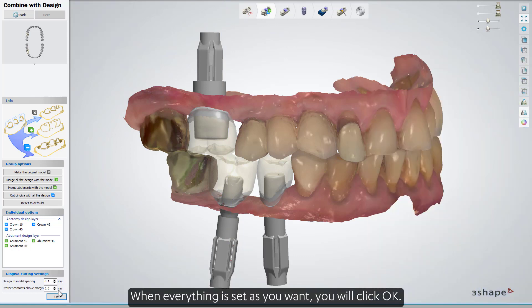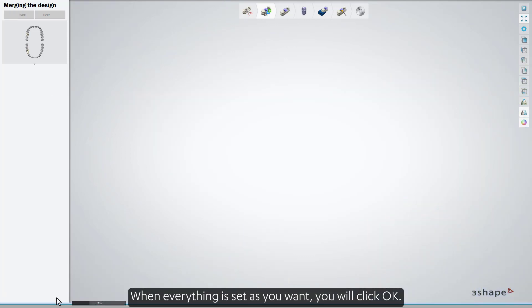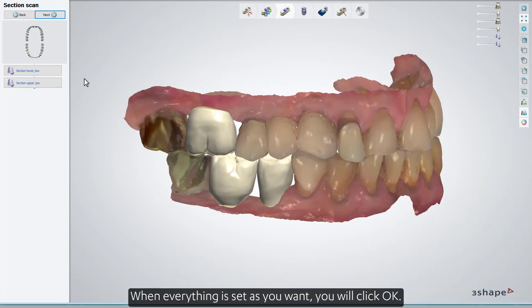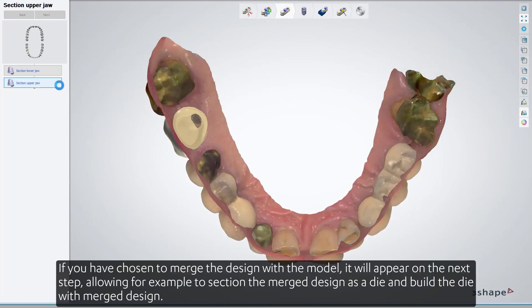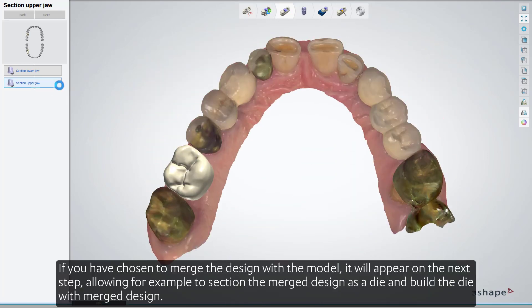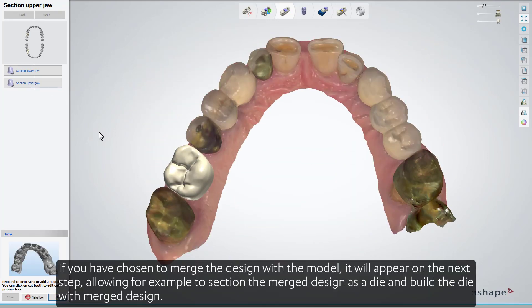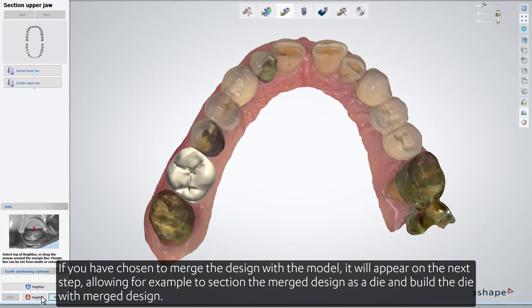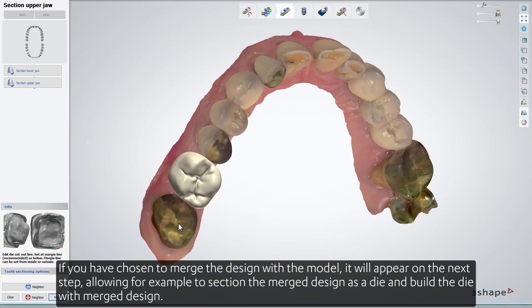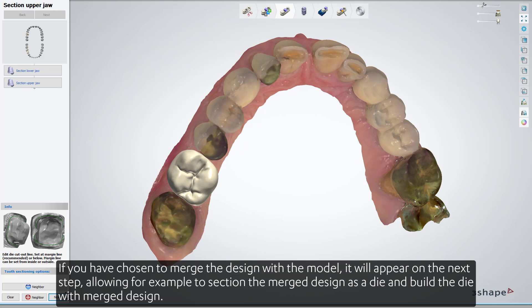When everything is set as you want, click OK. If you have chosen to merge the design with the model, it will appear on the next step, allowing, for example, to section the merged design as a die and build the die with a merged design.